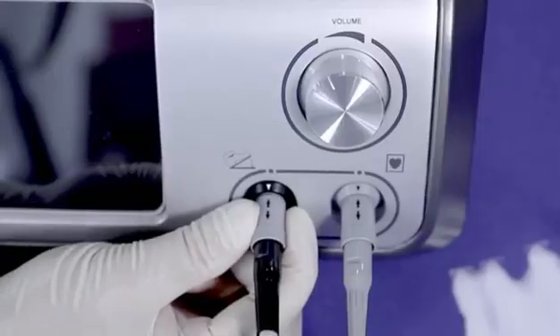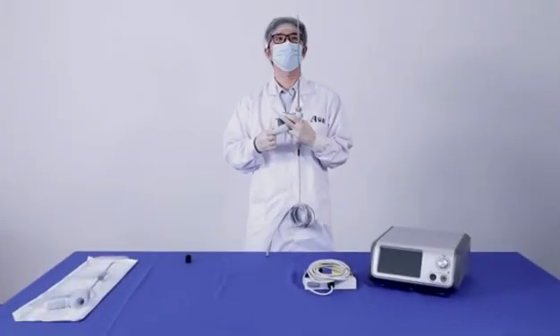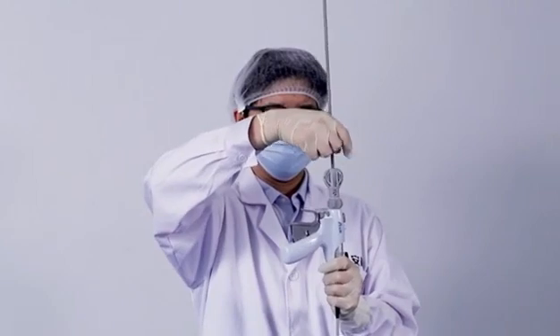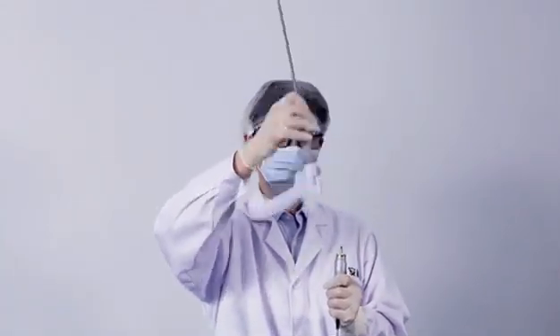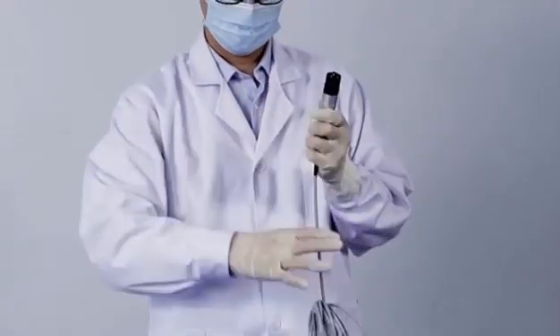Disassembly. Turn off the generator, then unplug the foot switch and transducer. Disassemble the transducer. Close the clamp arm and slide the torque wrench onto the shaft. Hold the transducer vertically. Turn the torque wrench counterclockwise until the transducer is separated from the scalpel. Note: place the protective cover back on to protect the transducer.